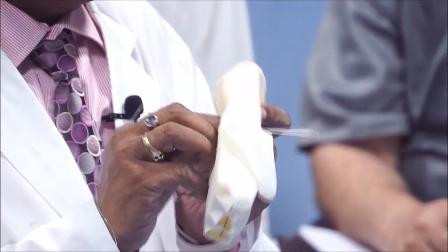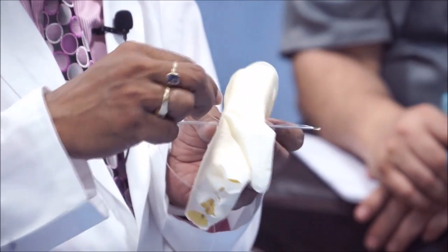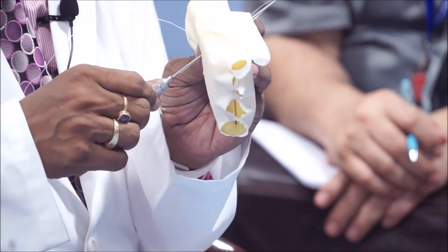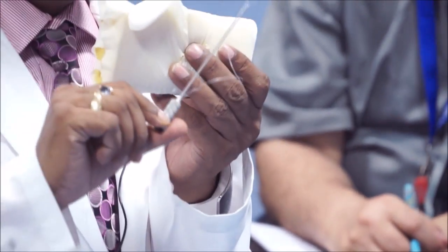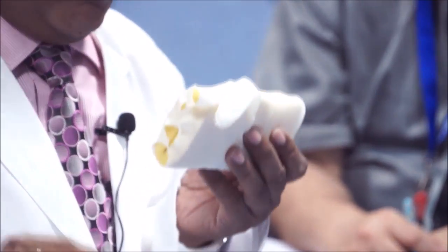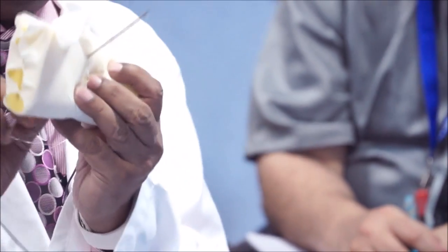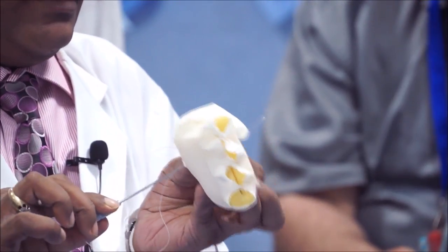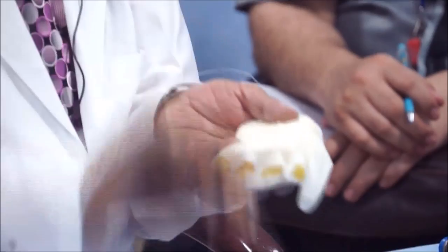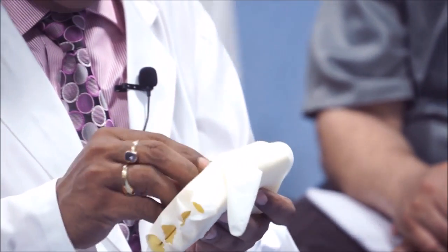And you are in. All the port closure is done under vision. And then you put the finger over the longer thread and pull the smaller thread out. Here you are out. But still this tip is in. Now you go from the other side and pull it. As soon as you pull, a loop is formed. Can you see a loop? There is a loop. And then just entangle this suture and pull this suture out. And it is out. And then tie the knot. It is done. See here.